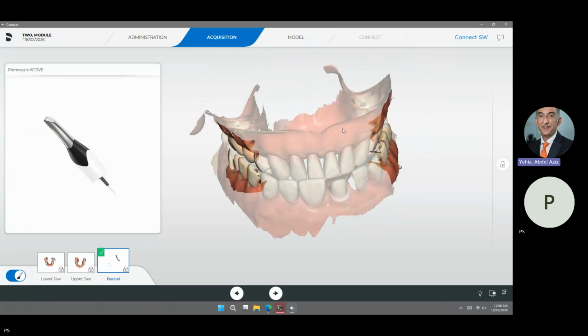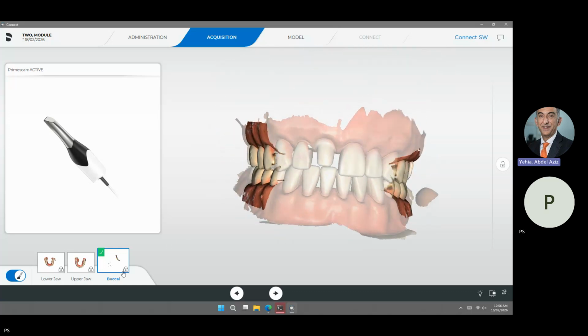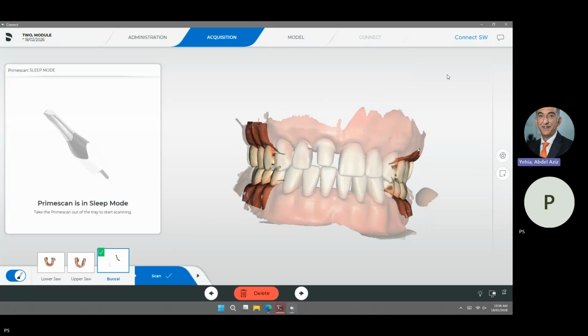So as you see, the scan is now locked. You see these locks on each and every folder. You need to unlock and unlock. And then you see that you can scan more if you want to do any scanning, or you want to take videos and pictures. We are on the scanning now. In the next modules, we will also discuss 2 important features in the scanning.